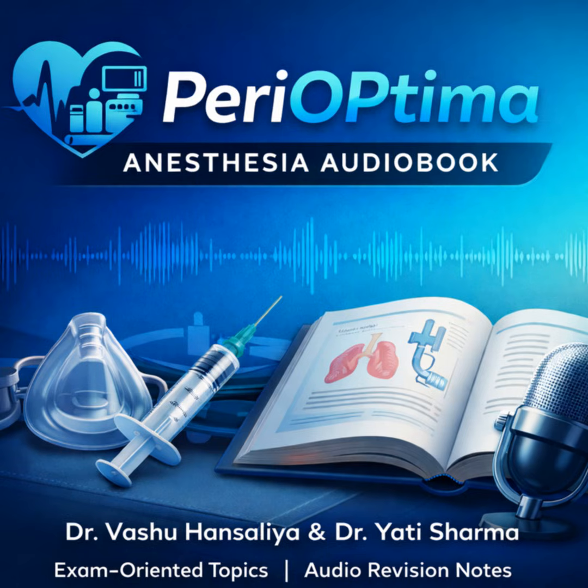And the worst case scenario. Grade 4. You can't see any recognizable laryngeal structures at all, not even the epiglottis. You're flying blind. But the modified Cormack-Lehane grading adds some crucial detail, especially to grade 2. It does. This modification provides better, more reliable information. Grade 1 is still a full view, but grade 2 is split into 2A and 2B. Right.